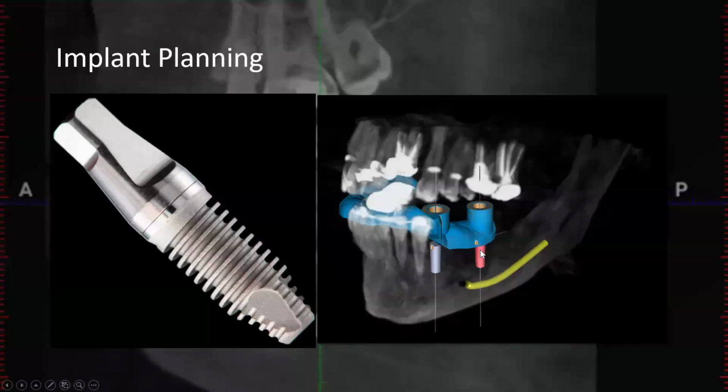And now they have, you probably weren't here, but I think it was last year they had someone coming and showing us how a robot works. They have these surgical robots. You do the implant planning in the software. You choose the direction it needs to go in the bone. You choose the depth, and the robot actually directs your hand to place it in just the right plane.